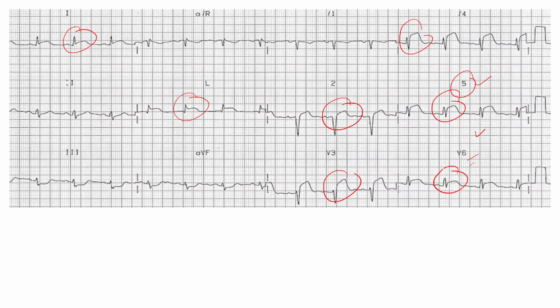Okay, so you can tell this ECG as, and you can also look for the QSs, which I forgot to tell. QSs are present in V1. The only negative wave in the QRS complex means it is QS, or you can tell it as a QS complex. In V2 also you can appreciate the QS.